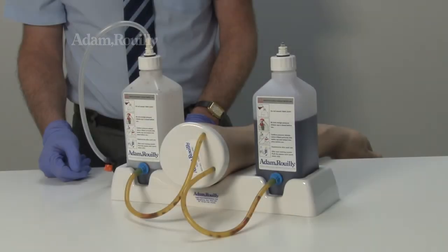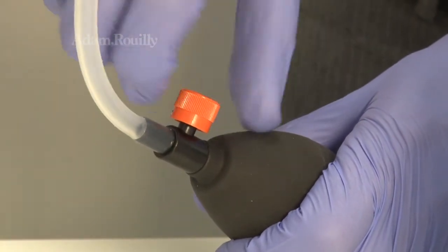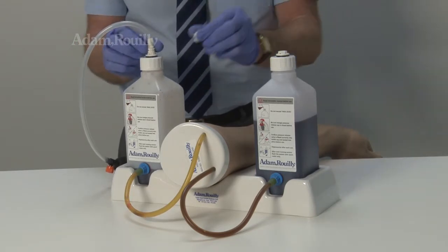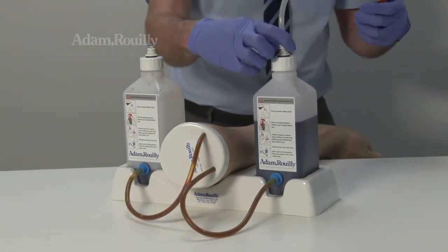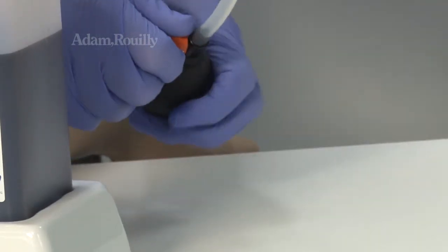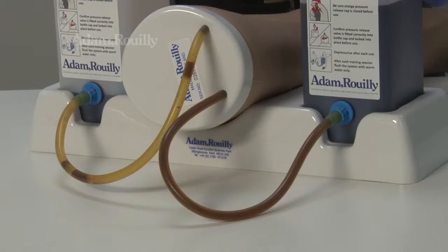When blood has emptied from the first bottle, the bulb can easily be swapped to the other bottle so use may continue relatively uninterrupted. Simply depressurise the system by opening the orange cap and swap the tube, bulb and pressure release valve onto the opposite bottle caps as shown. Close the orange pressure release cap and pump the bulb to start the flow of blood again and continue using the arm.